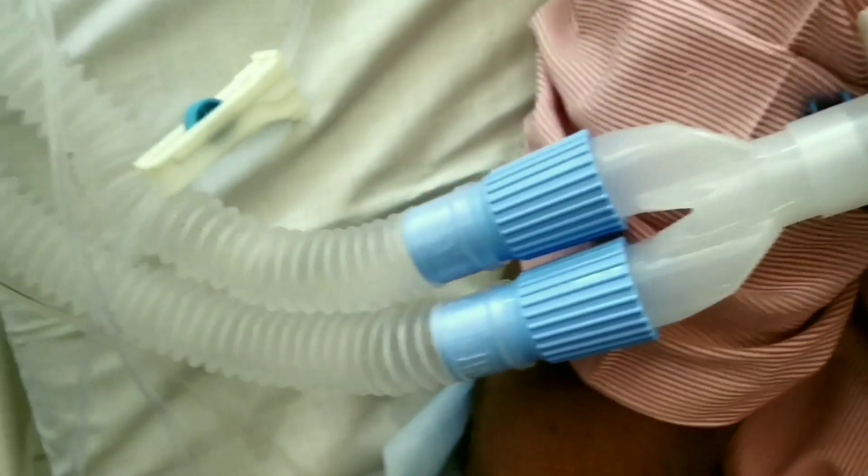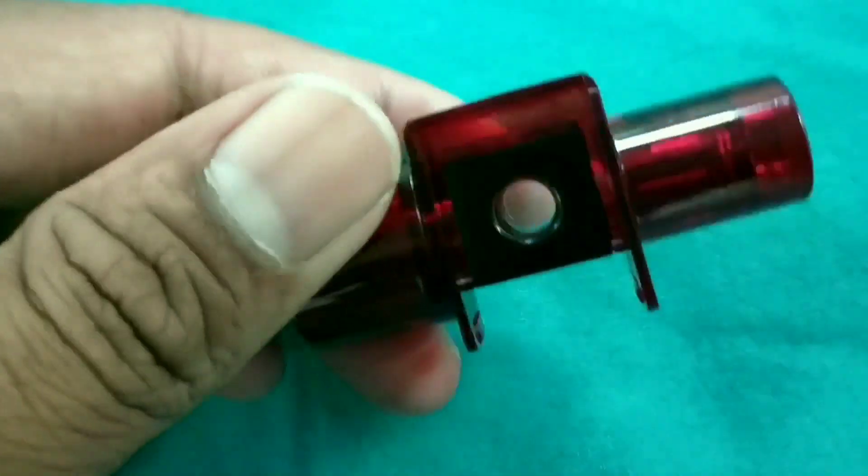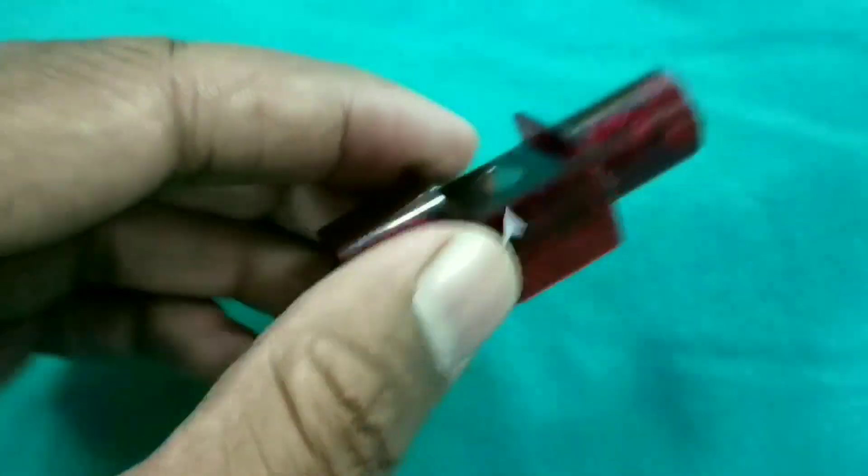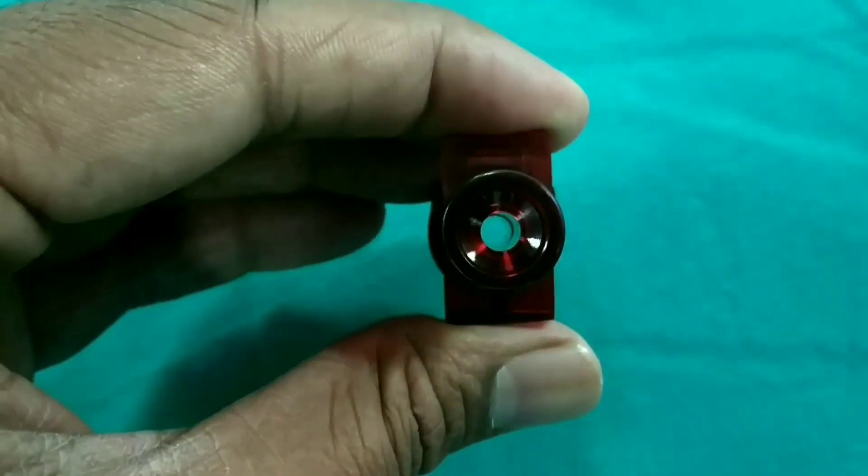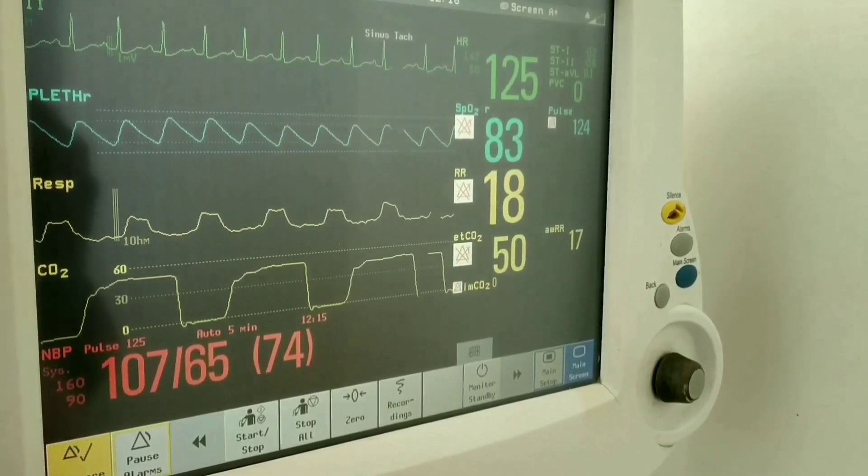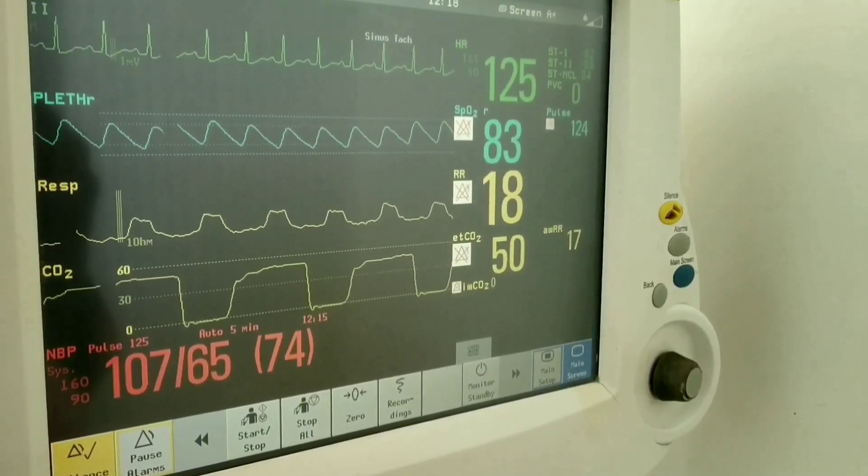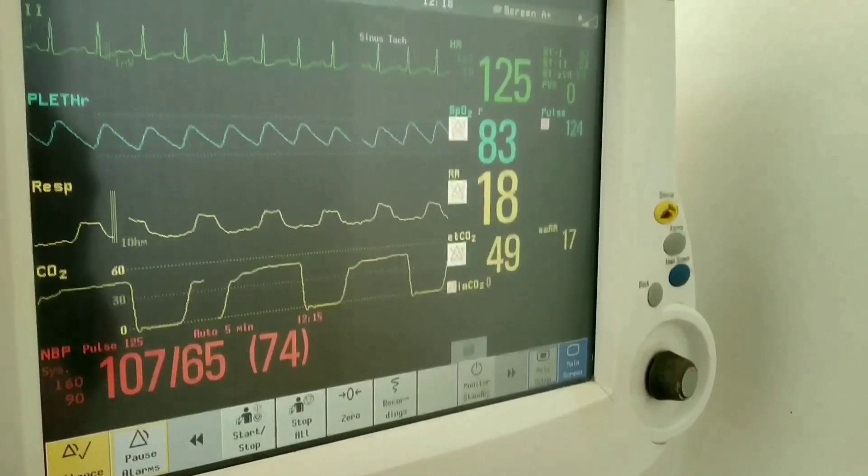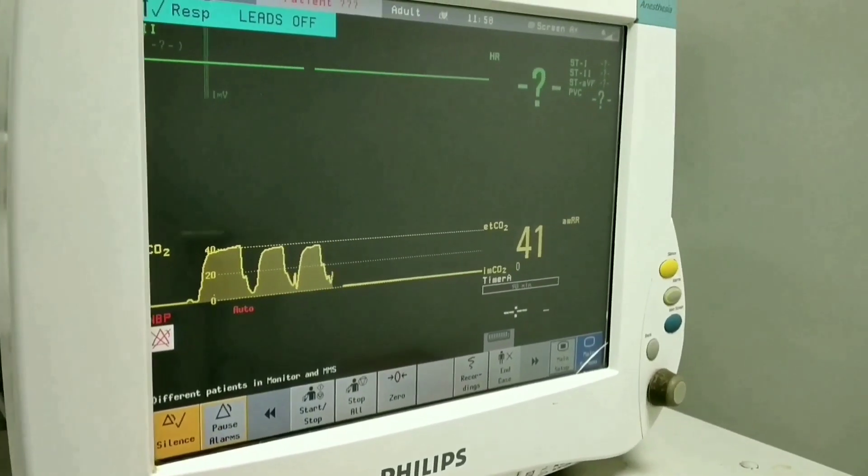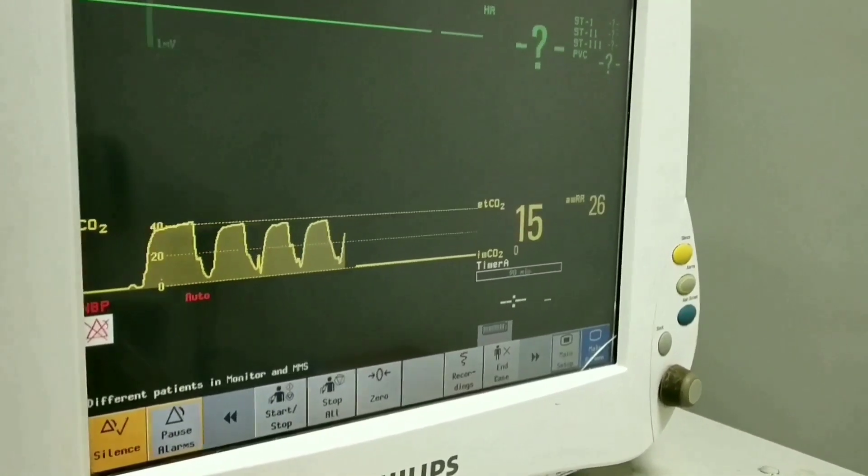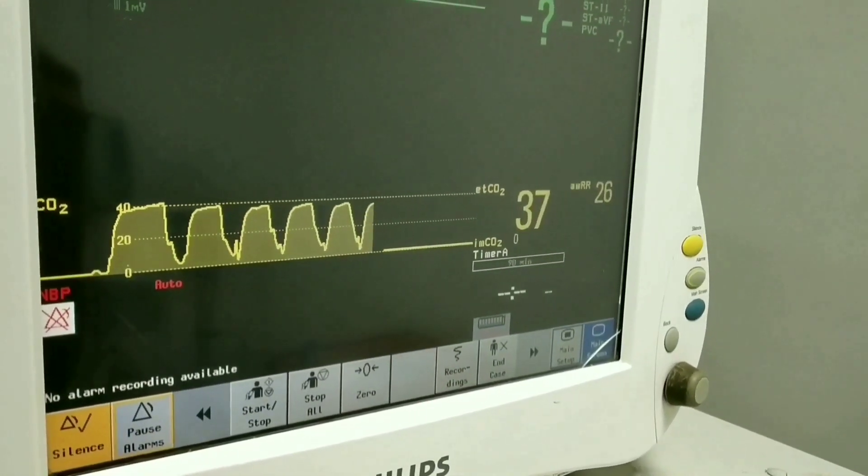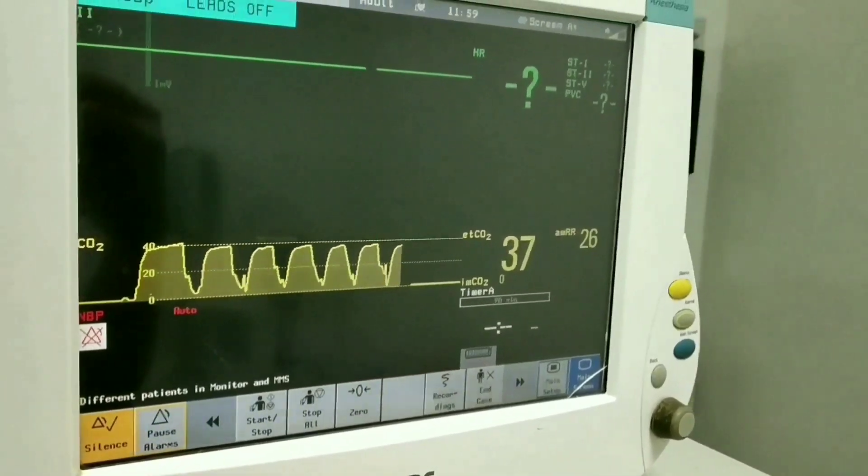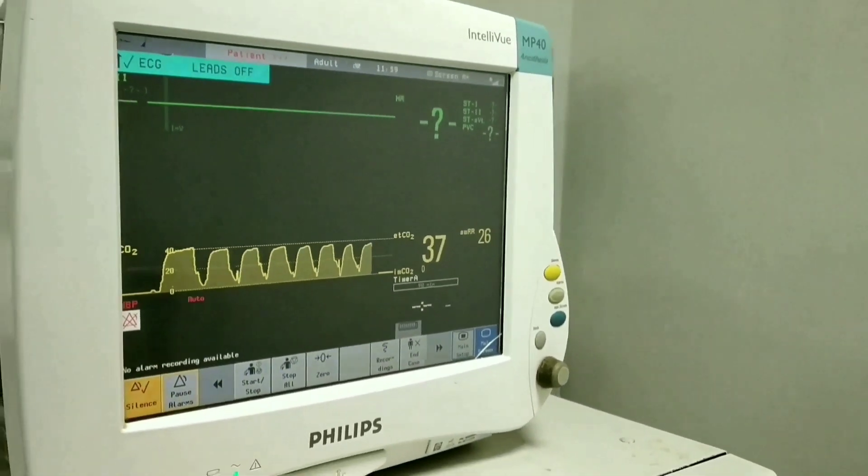This is the ET CO2 setup. This is an airway adapter from where the IR travels to the detector, and in between that air passes through. This is the patient monitor where you can see the CO2 reading of 50. This is while testing the capnostat; the readings that we can see on the monitor are 37.